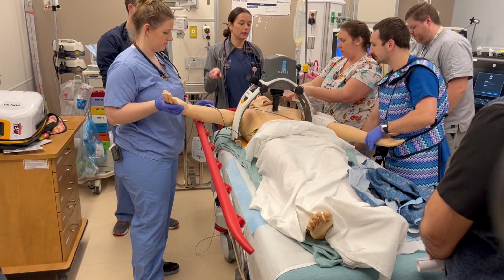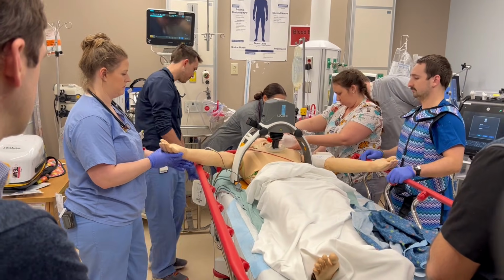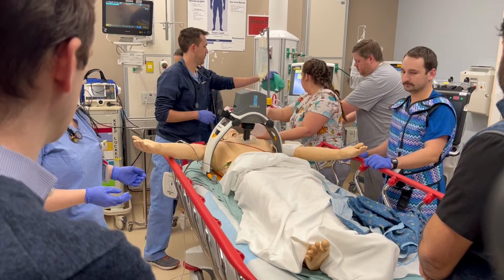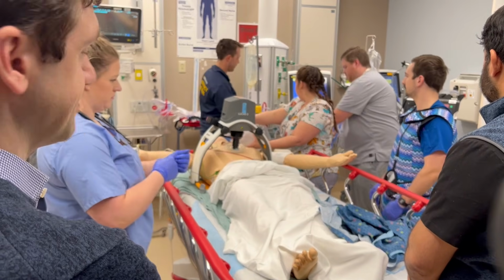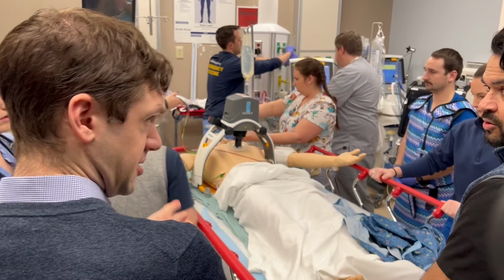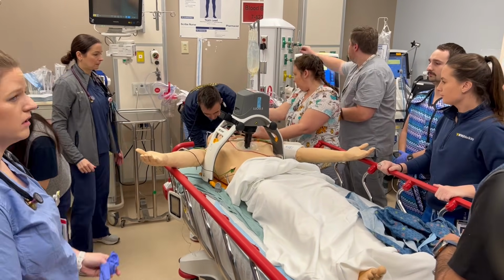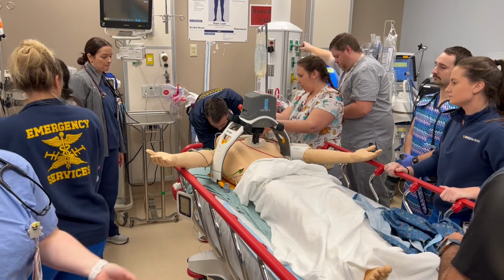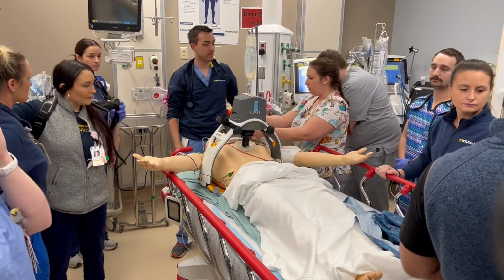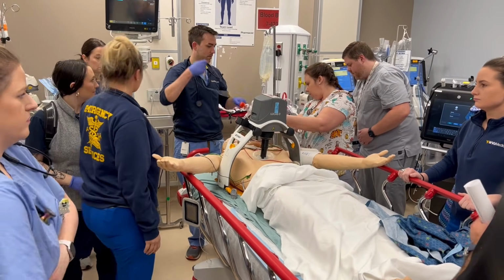Okay, does anyone need to do anything before he gets transported? All right, so Jamie will help with the bagging. Are we going to the OR or the CICU? We'll go to the CICU. Do we have the transport medication ready? Yeah, I have the calcium and bicarb. Okay, perfect. And who's going to go with us?